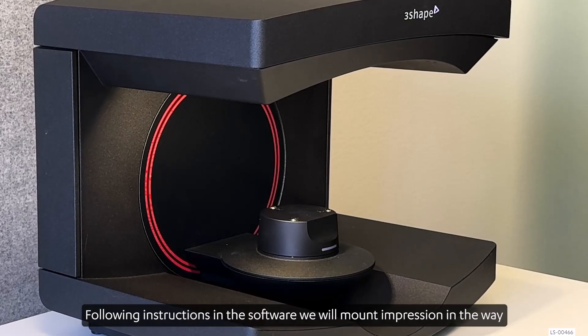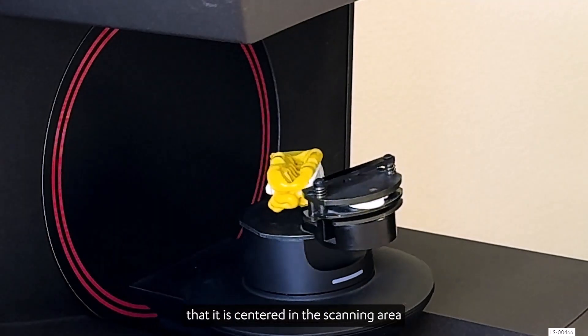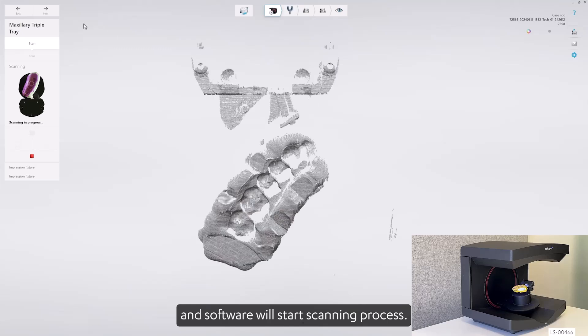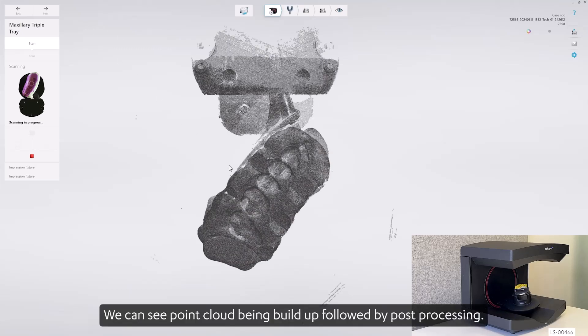Following the instructions in the software, we will mount the impression so that it is centered in the scanning area, and the software will start the scanning process. We can see the point cloud being built up, followed by post-processing.